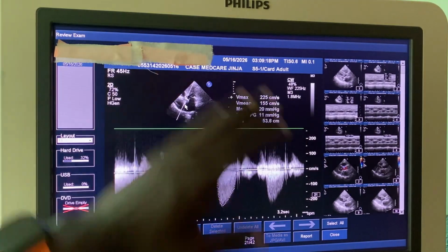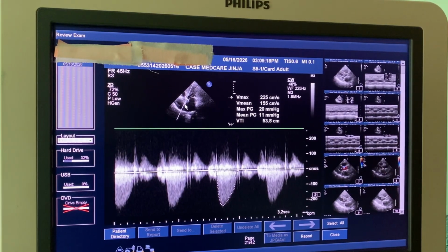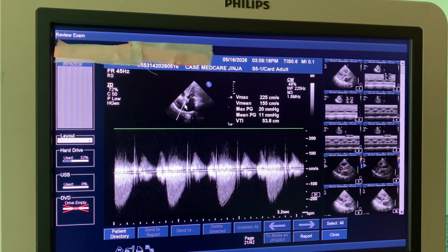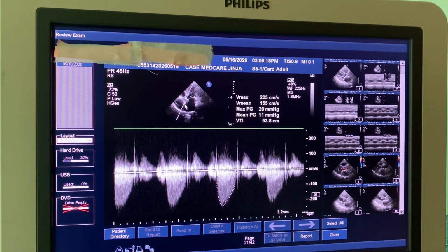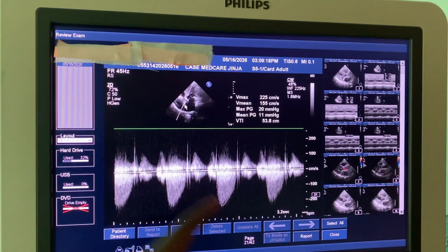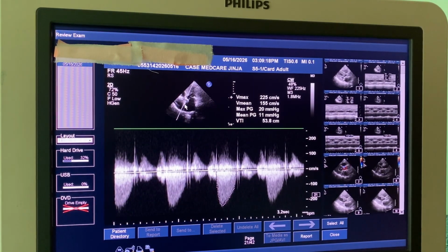First thing, when you find such a discrepancy, where all the measurements are not tallying, not agreeing, you have to go back in case you made mistakes. It requires multiple measurements. I did multiple measurements with this one, and this was the highest, just that I didn't save all of them. But you have to go back and recheck that you didn't make any mistake in measurements. In alignment, this person had the sigmoid septum, which you have to escape. You have to make sure you escape it.